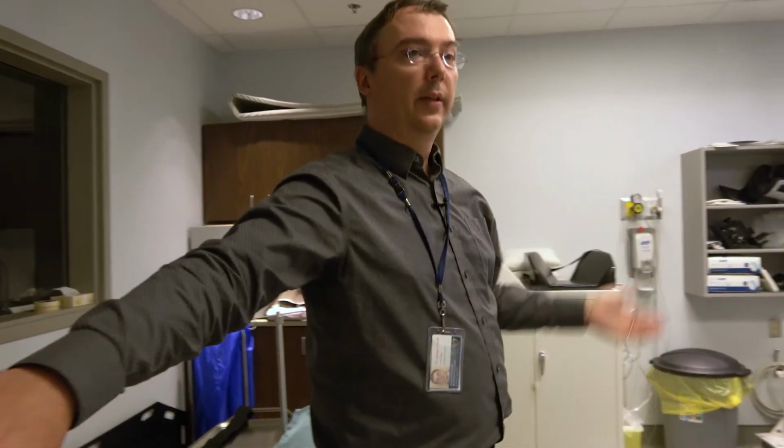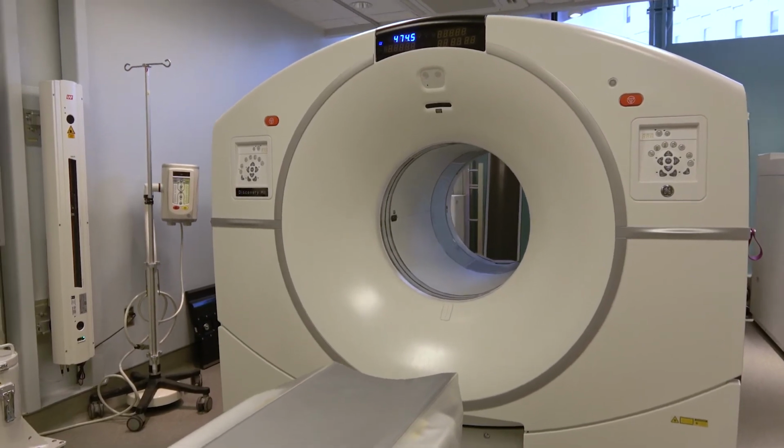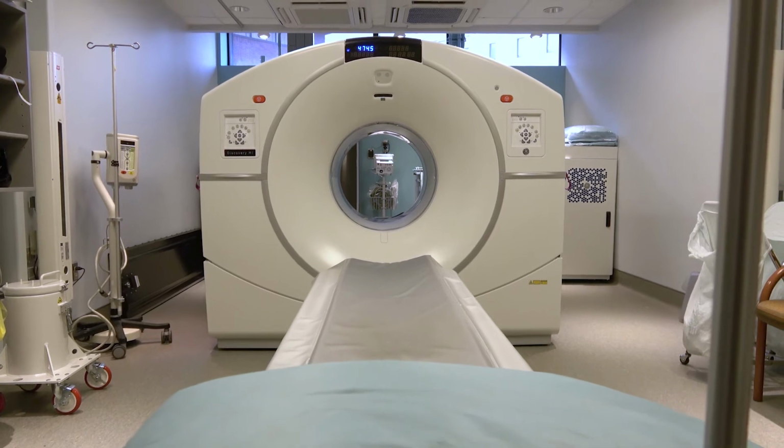So this is it. This is the beautiful new PET scanner that we purchased with the QEII Foundation. The patient would lie down on the scanning bed, usually with their head pointing into the scanner, and this is what we've got.